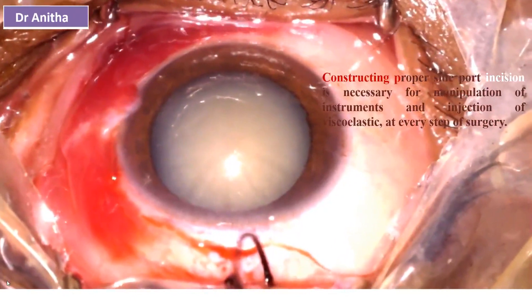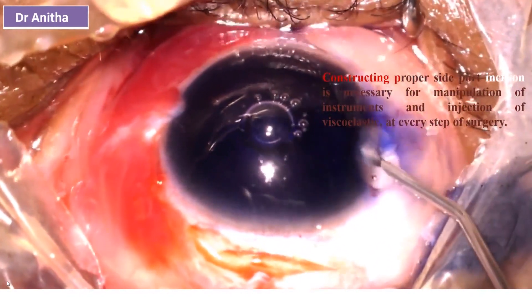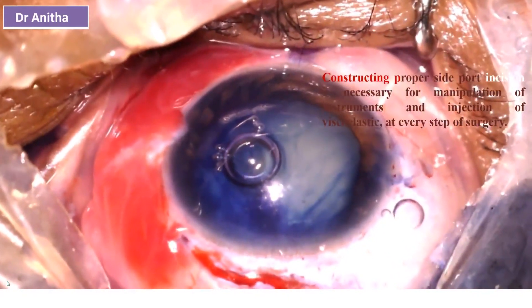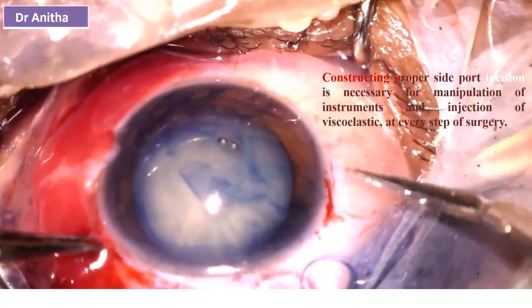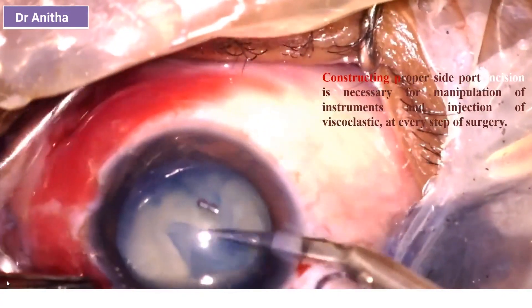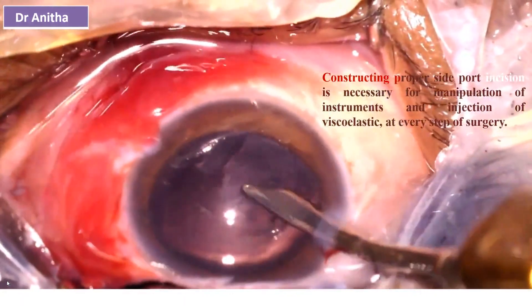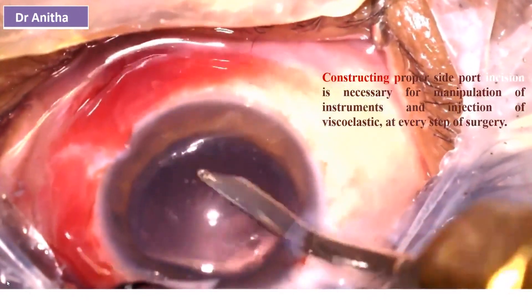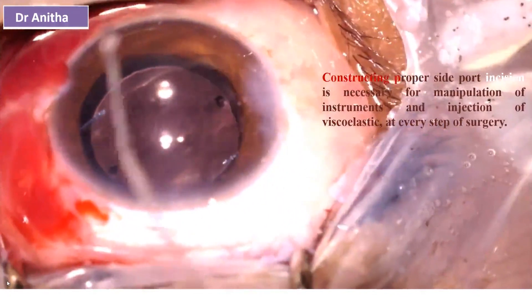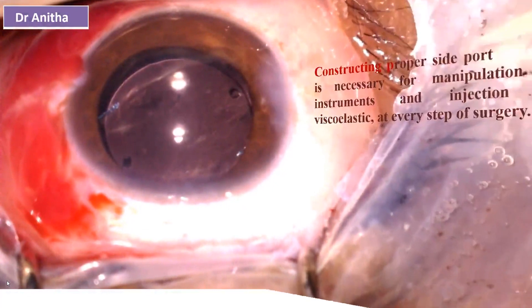This video shows how a proper side port is created at the limbus and how much knife entry is required. Constructing a proper side port incision is essential for manipulation of instruments such as viscoelastic cannulas, hydro cannulas, injection of viscoelastics, and for cutting with scissors during extended capsulorhexis. Aspiration of the cortex, including sub-incisional cortex, is much easier with a proper side port, and dialing of the IOL after insertion can also be done comfortably through it.